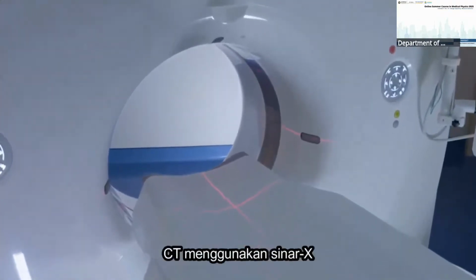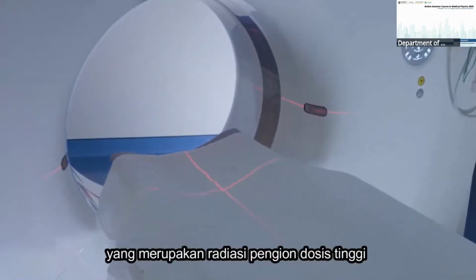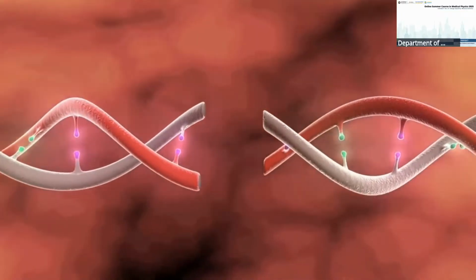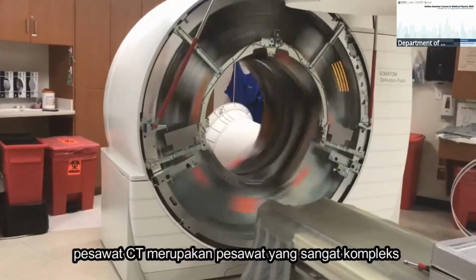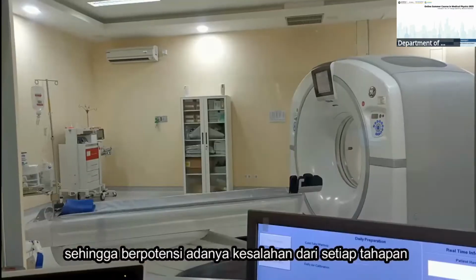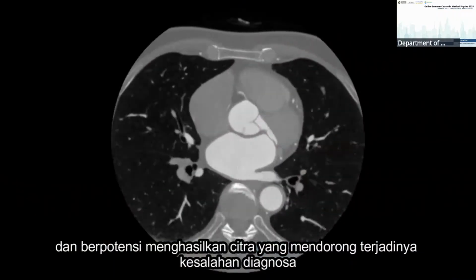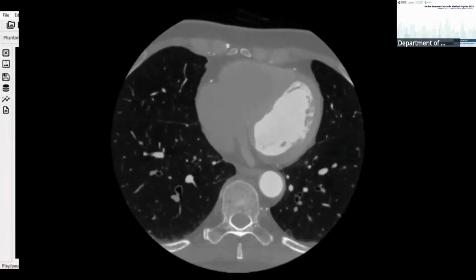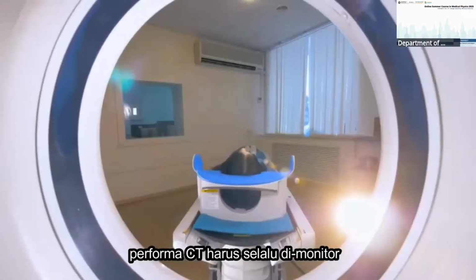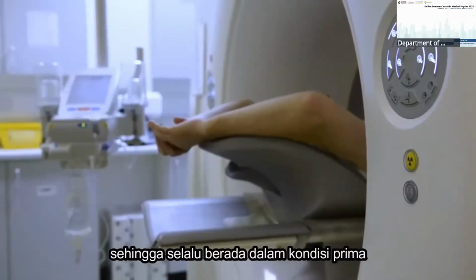However, CT uses X-rays, which are ionizing radiation, so its use can cause harm to the human body. In addition, the CT system is very complex, so there are potential errors from each stage that can produce images leading to misdiagnosis. To minimize this, CT must always be monitored so that it's always performing to standard.